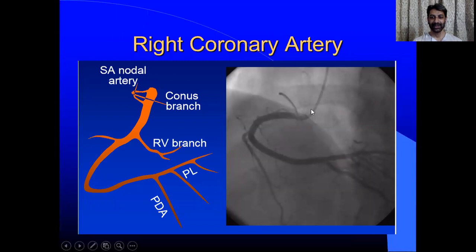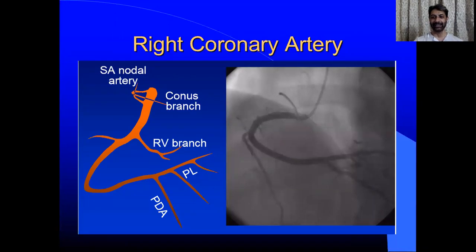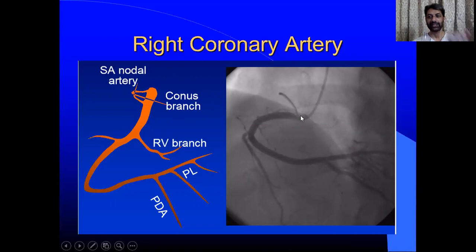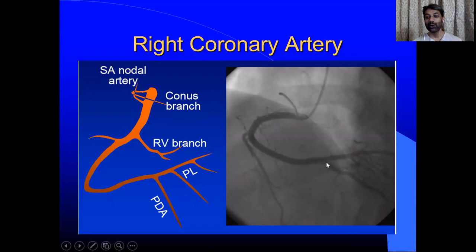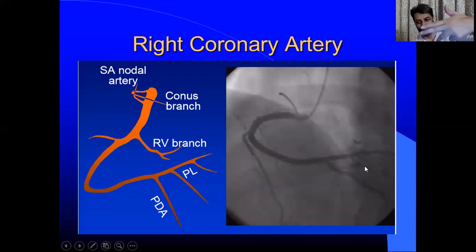This is the RCA you see. Always remember this — even those not posted in the cath lab can easily understand that this is RCA giving a sinodal branch and conus branch. There is a detail that sometimes these branches are separate and sometimes within RCA. Then this is acute marginal. And this is the point where RCA divides: distal RCA, Posterior Descending Artery, Posterior Atrioventricular, and then these branches are all PLVs — after the Posterior Atrioventricular further divides.